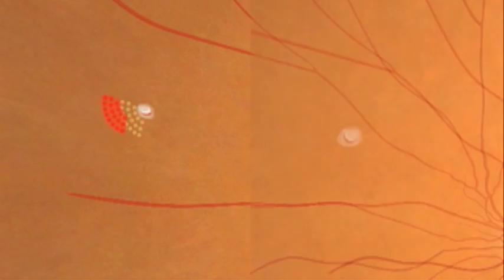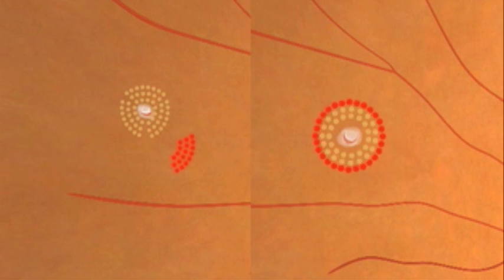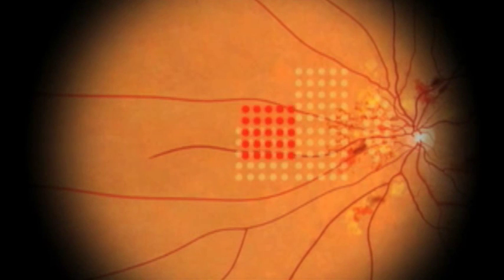For retinal tears, triple arc patterns, or a series of concentric rings, ensure a full seal with as few as three foot-switch depressions.